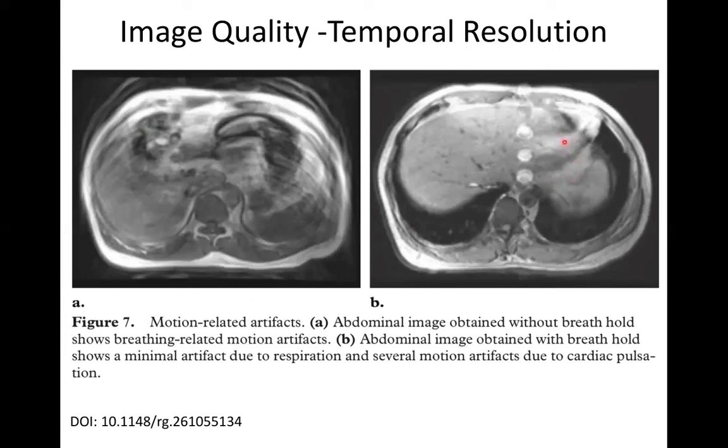And so at these levels, when you're asking what's the temporal resolution of MRI, you need to be able to compensate for both breathing and cardiac motion and lock the data acquisition into phase with both cardiac and breathing. Right? When you do that, you can share the data between those heartbeats and share the data at different phases of the respiratory cycle, or get the person to hold their breath and get rid of that effect of low temporal resolution.